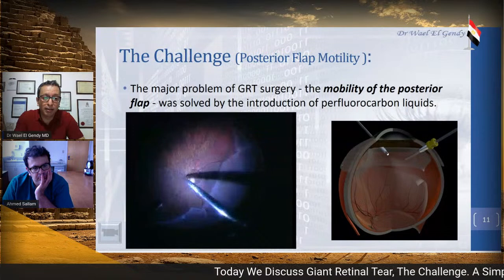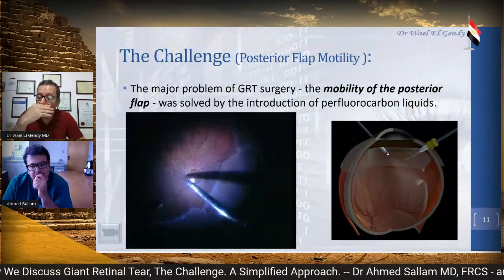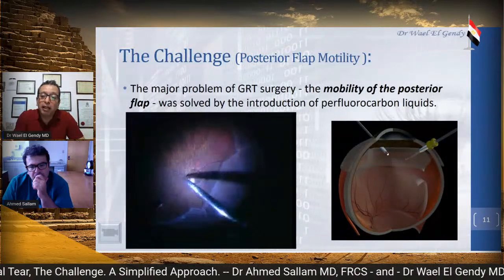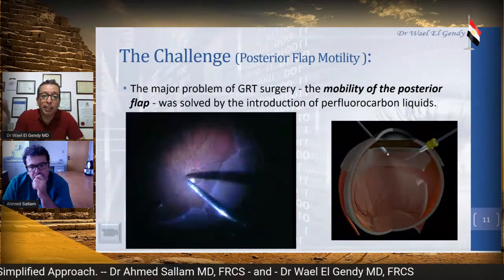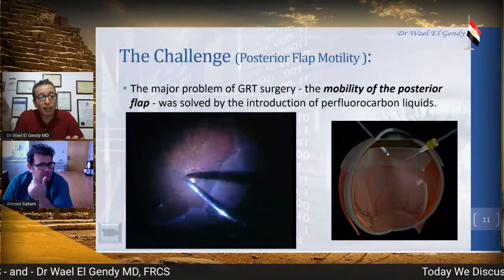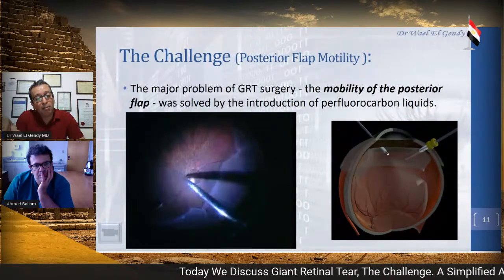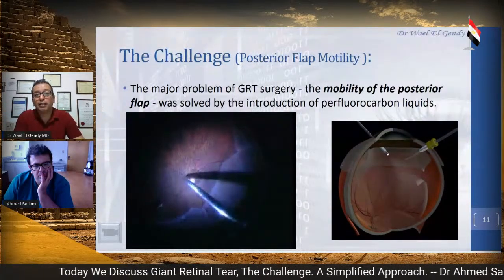It's not going to be viable, so it will lead to proliferative changes also. So I think it would be fair to say that we would laser it all down all the way, so it would be stuck to the retinal pigment epithelium and the choroid, but still covering them without exposure.